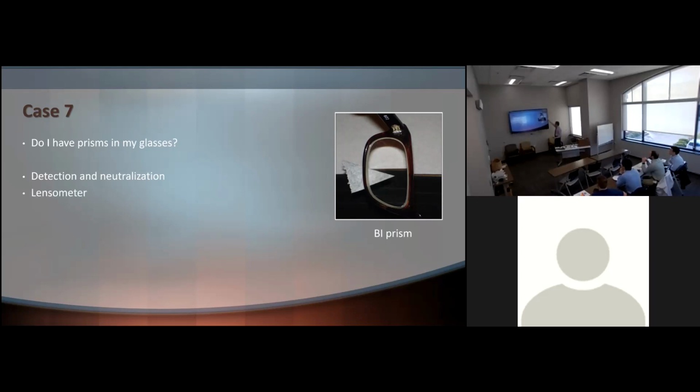So I hold two prism diopters and see if I can get the line continuously straight. If not, I add maybe 4 or so. So you hold it in the opposite direction. Or you can use the lensometer.